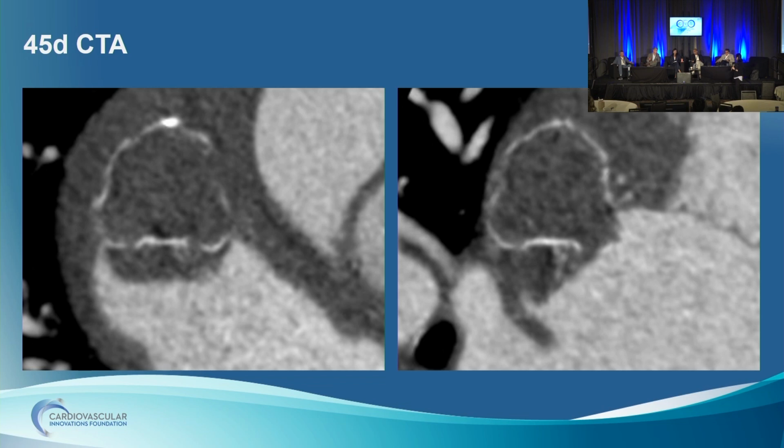Because these patients have a tendency to recur in terms of DRT. You could have a small area on the face of that device that's unendothelialized or is reluctant to endothelialize, and that would be a potential nidus for DRT in the future. Yeah. There is something else in this patient other than the device itself. There is some procoagulant state. This is not commonly seen.